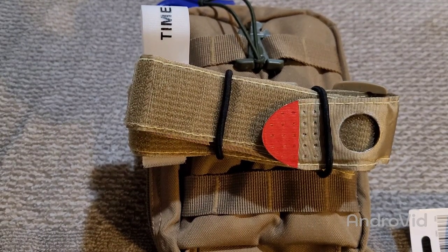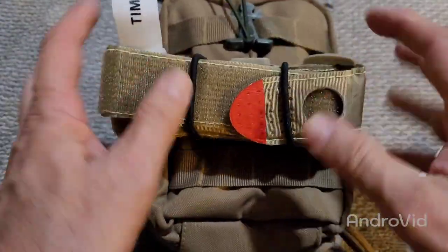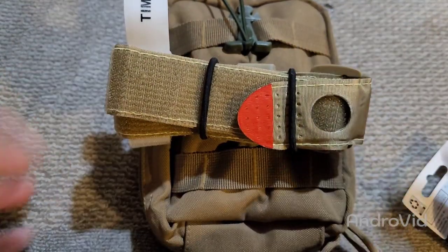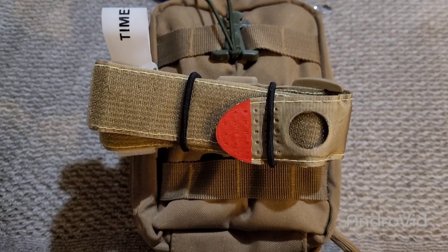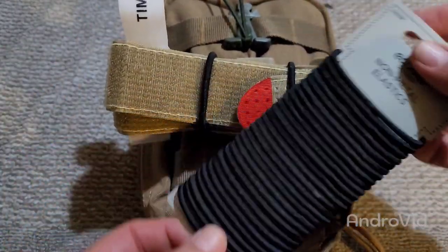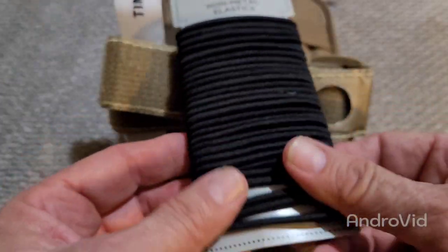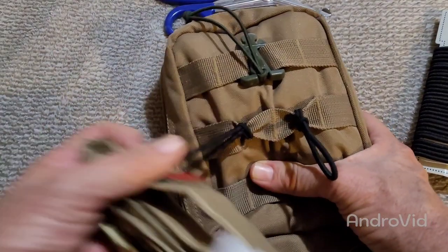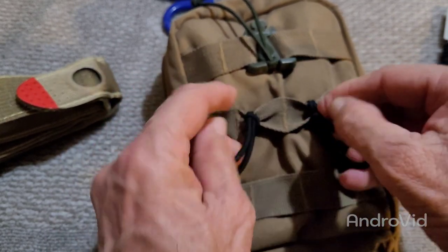Let me show you the next method — something else you can use to attach them with. This is probably something y'all are familiar with, just an IFAC kit. I took my scissors out so I can show you this. You want to use something that is easy to get the tourniquet off with. Some people tell me they use rubber bands. I'm not too fond of rubber bands in Texas — it gets really hot here, and if you leave something in your car, they will definitely degrade and deteriorate. So what this is is just some cheap little elastic hair ties. They're easy to detach and gone. I just kind of looped it in there and that's it.